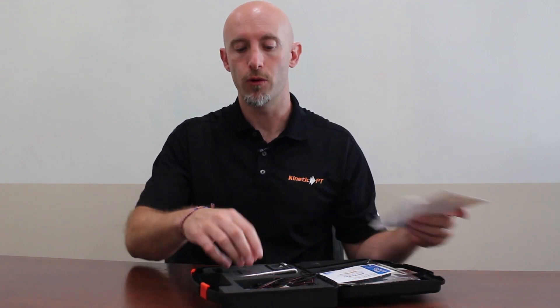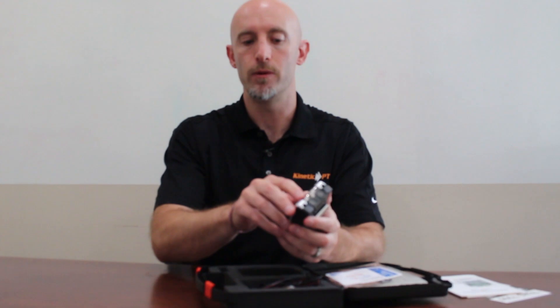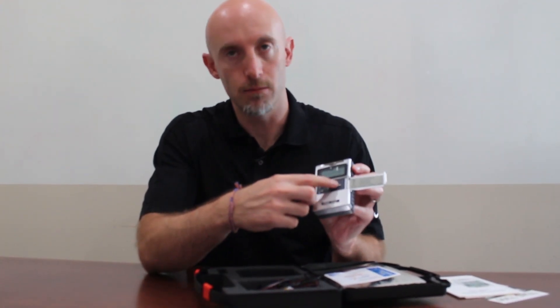When I take this apart, this will be very important for you to be able to do at home. Here's your unit, here's your device. When we open up the device, we'll see a set button, arrows up and down, and a mode button as well.